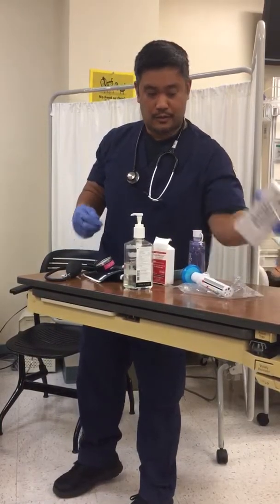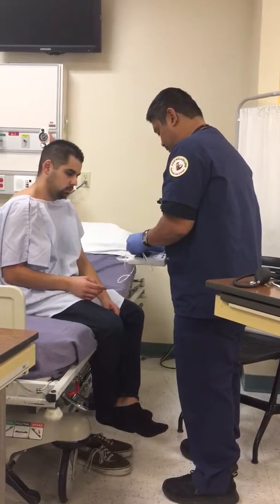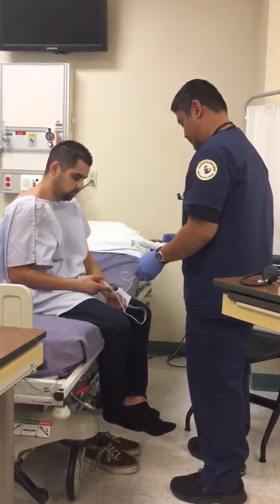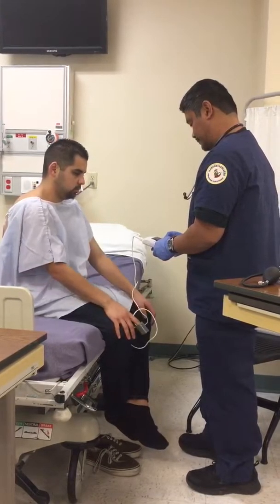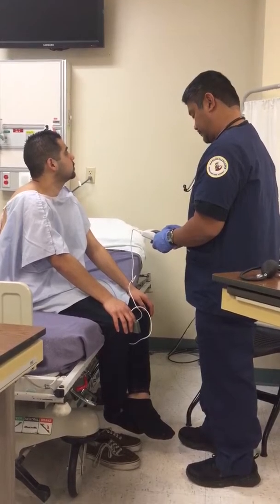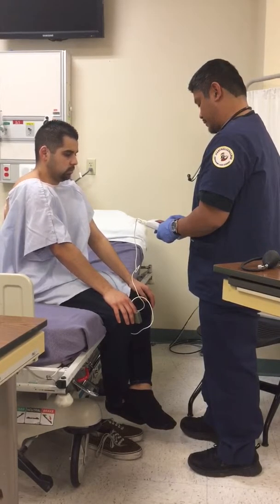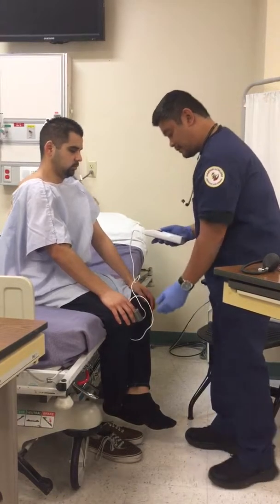So let's take your saturations here. So I'm putting on your finger. All right, thank you, Christian. So you have a saturation of 98. That's good. Thank you.